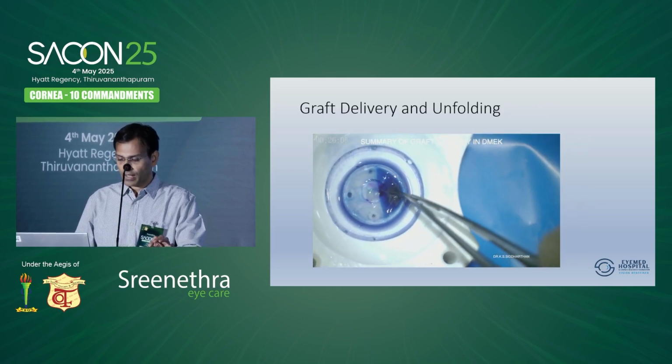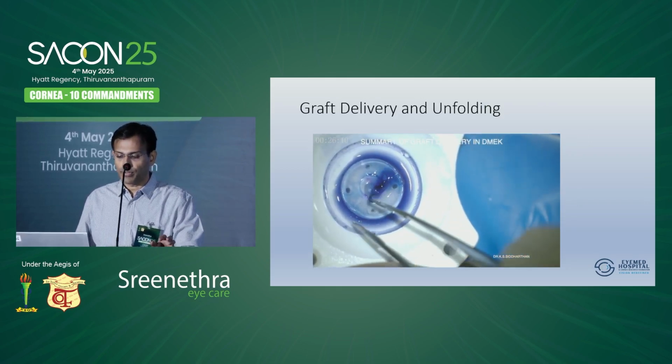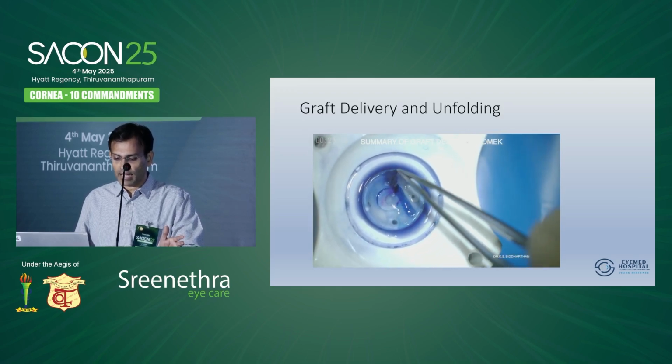And here the same, I showed you removing the endothelium out. Sometimes you have to be very careful. Sometimes the punch may not go in. You might use the punch twice or thrice. Go to that area and release it.